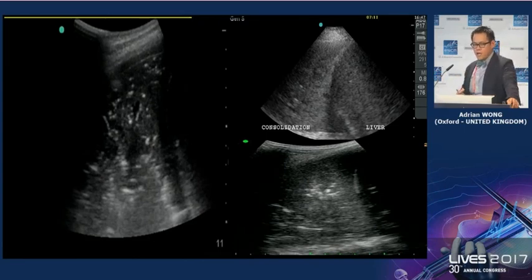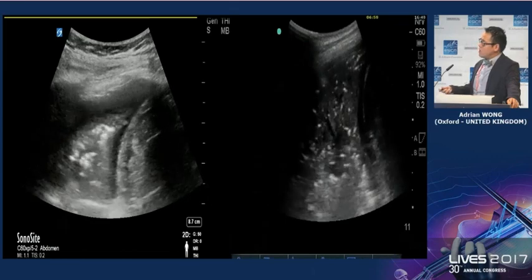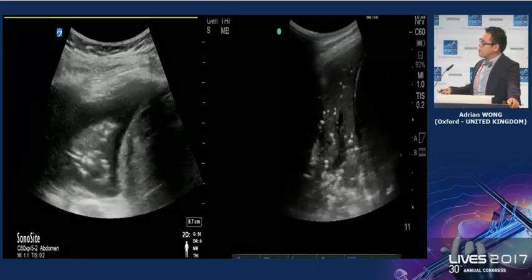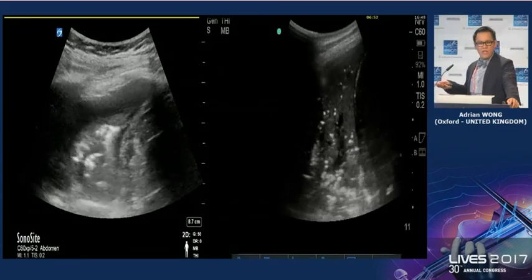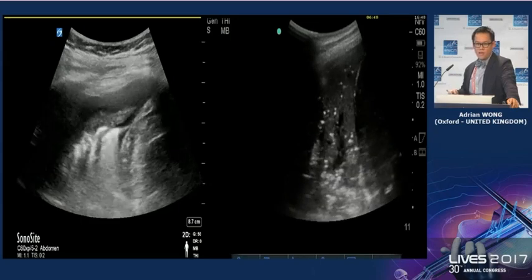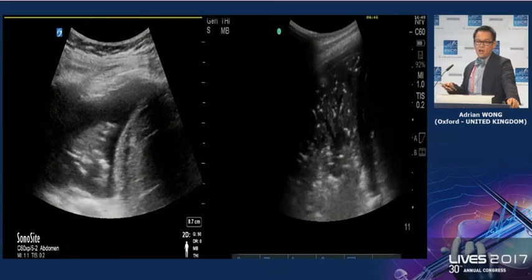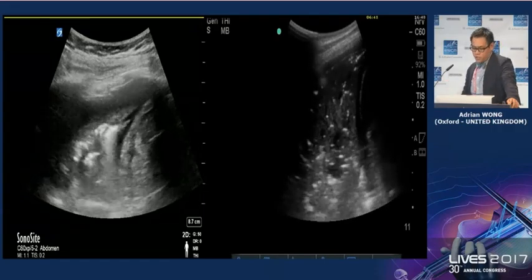Once you start scanning in your intensive care unit, in your emergency department, you will pick this up much more readily, and they are more frequent than you think. Again, more pictures, sliding in during the respiratory cycle. Look at all the punctate echoes of debris in the lung itself. Remembering that normal lung is boring. It's just a bit of A lines here, maybe B lines, but when pathology happens, it is fairly obvious pathology happens.